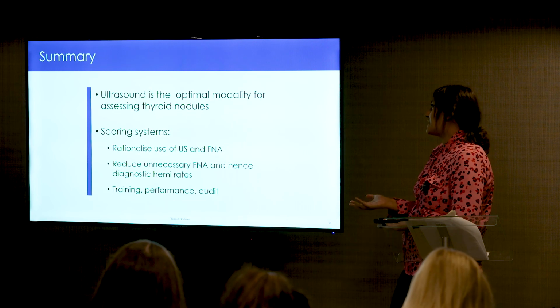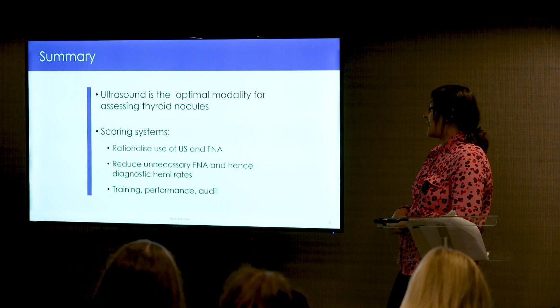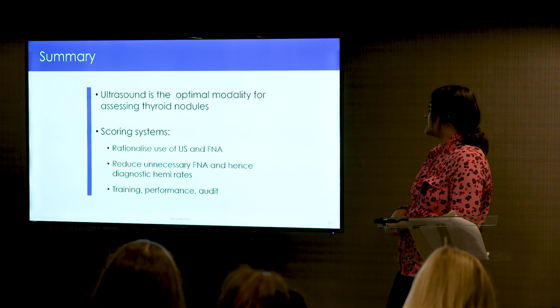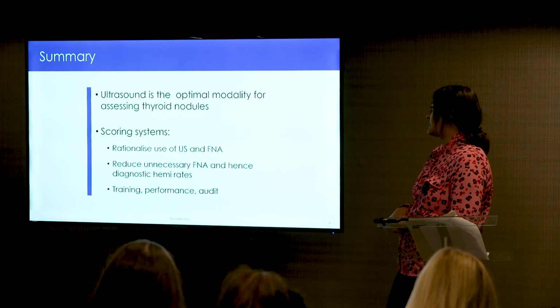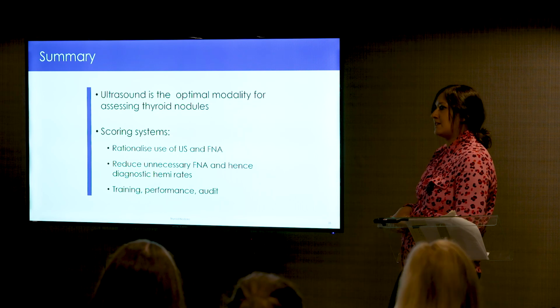So just to summarise, ultrasound is the gold standard for assessing thyroid nodules, and the use of scoring systems is essential for risk stratification and having robust training, performance and audit in place.